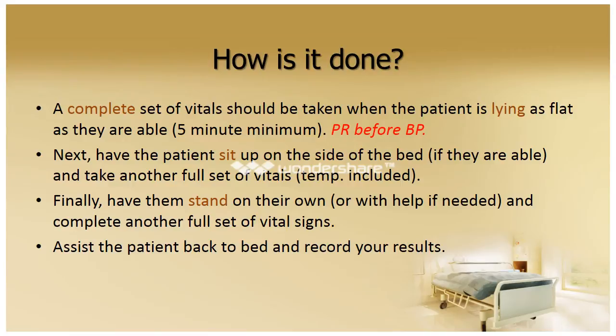So if you have any questions, be sure to talk to your nurse about the safest position to put your patient in, because we don't want to put anyone in distress by lying them too flat. The Institute of Medicine suggests that we don't let patients go out to smoke or have coffee within at least 10 to 15 minutes before having the orthostatics taken. 5 minutes of rest minimum before we do these.